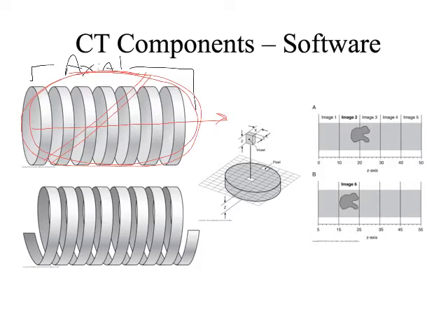What we are interested in is this kind of data set down here, and we're going to call this helical. Now it looks kind of like that slinky I had earlier, right? Now, what's so great about helical? This is a volumetric data set. It's acquired at a slight angle. We can see it has a little bit of an angle to things.